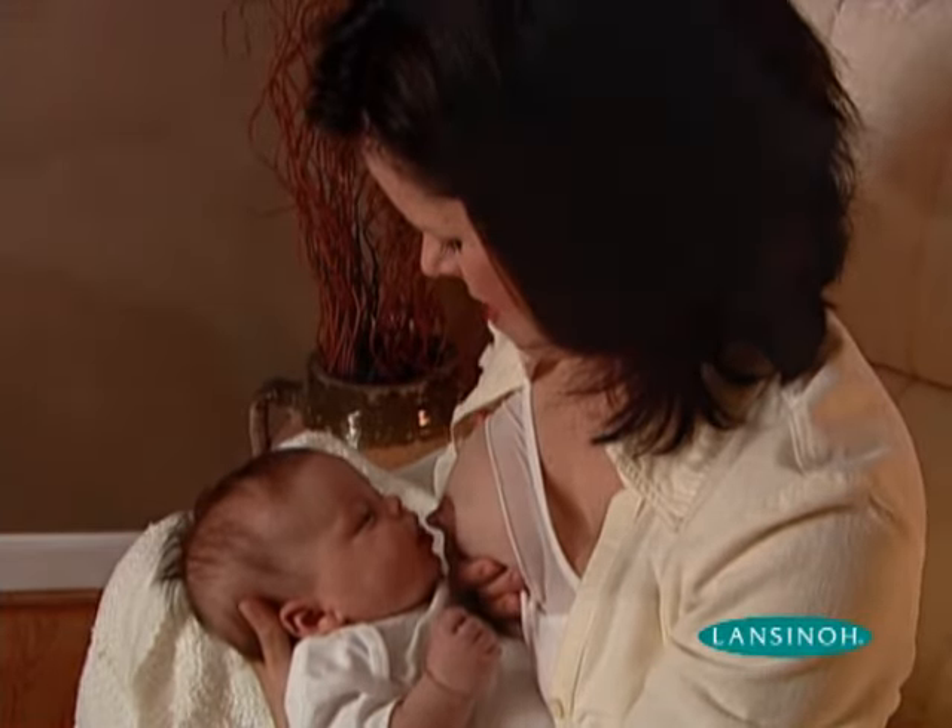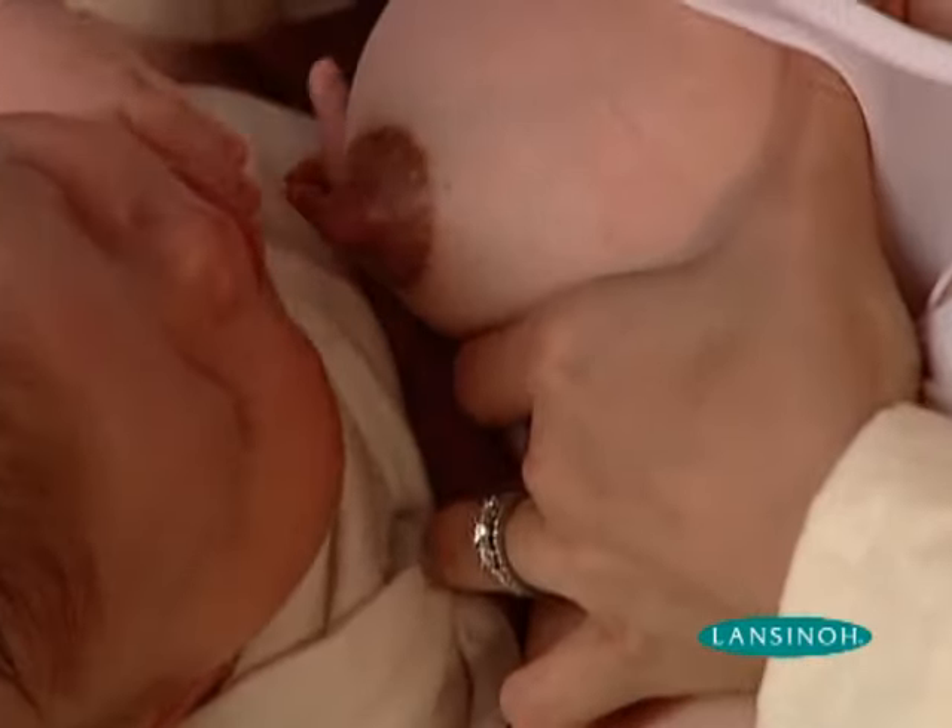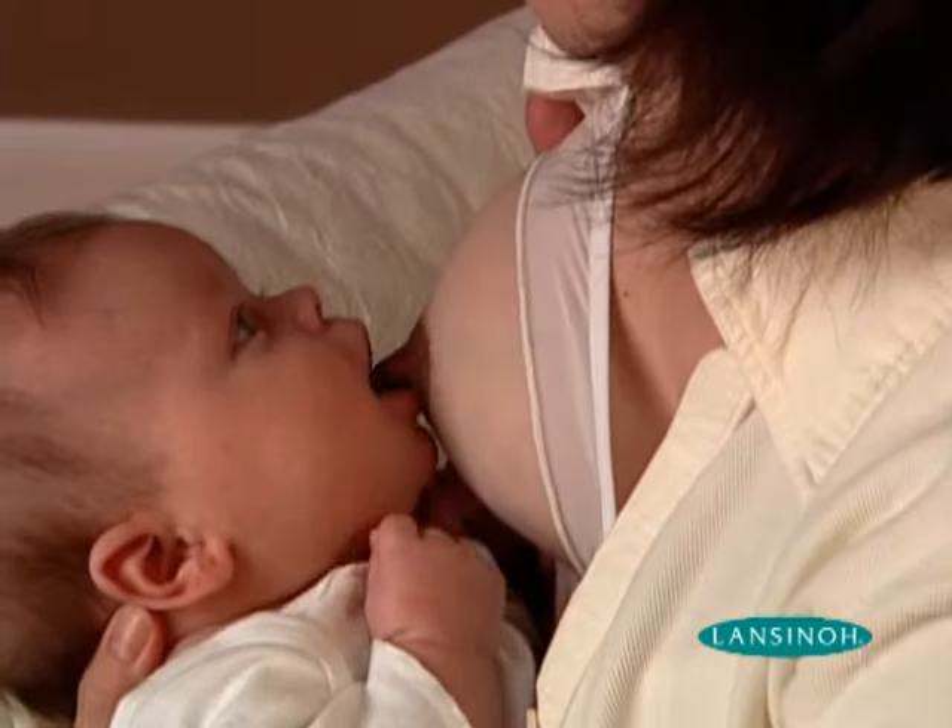Once your nipple is everted or drawn out, put the Latch Assist aside and latch your baby onto nurse.